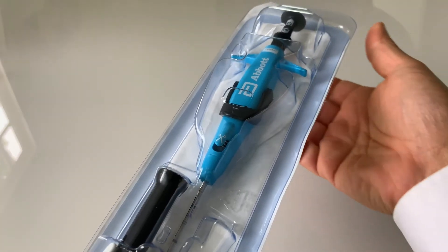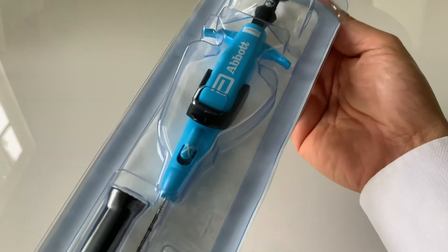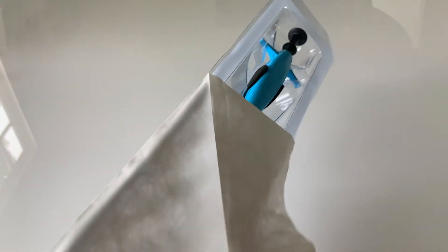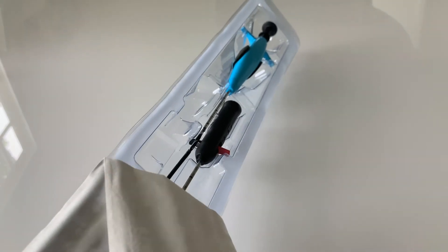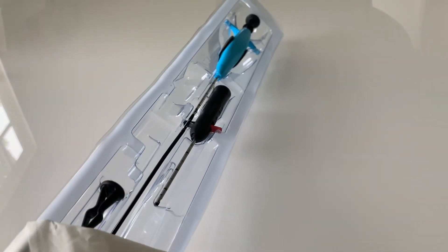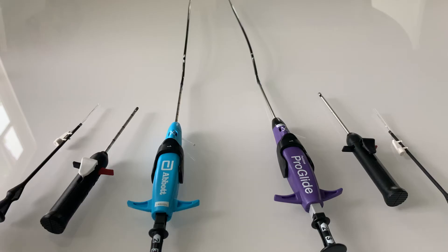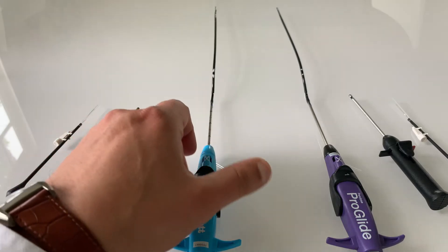It is packaged the same and can still seal holes up to 21 French in an artery and up to 24 French in a vein if you utilize two devices. Now while the ProStyle looks similar to the original ProGlide, there have been a number of incremental design improvements.